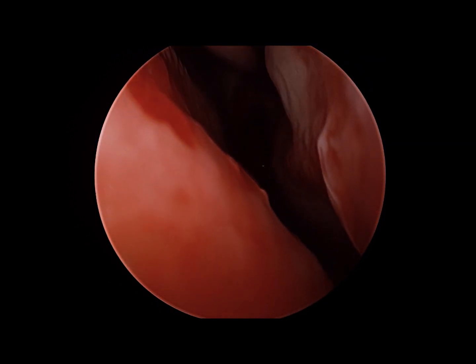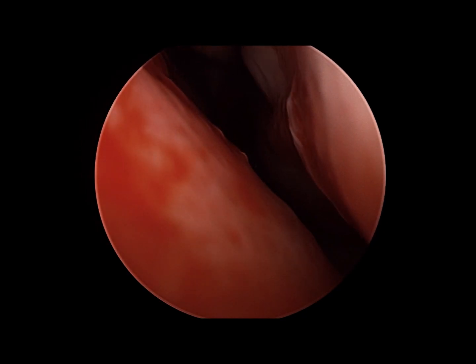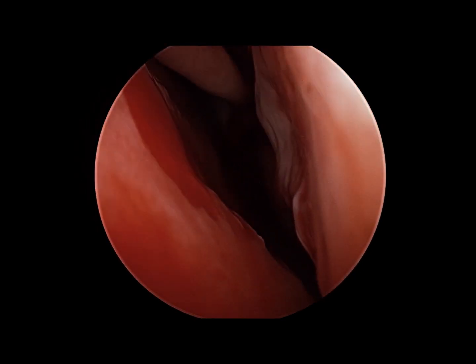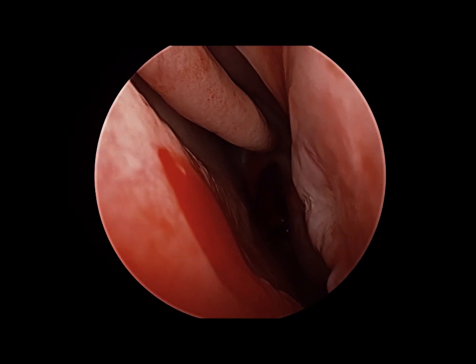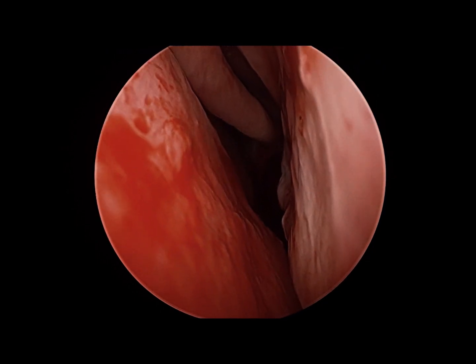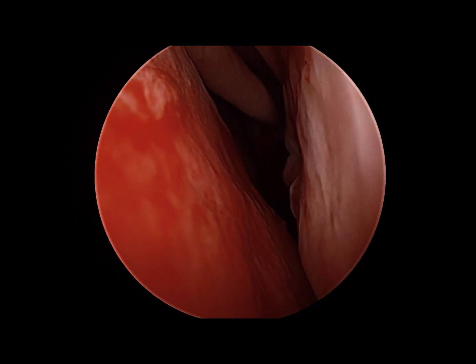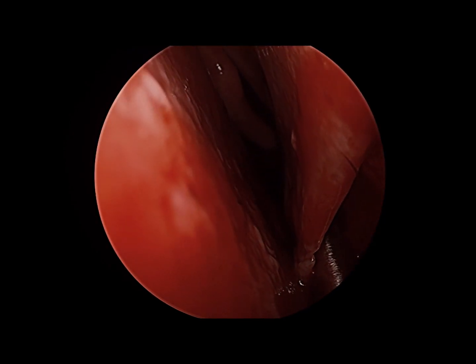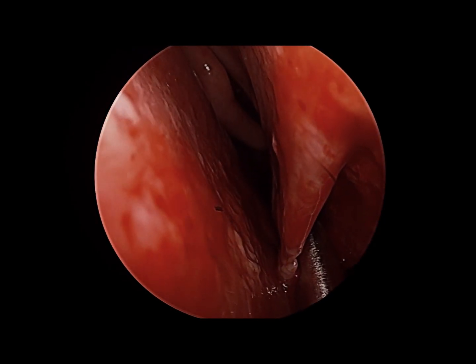Removal of inferior turbinates via scissors excision is not advised — that can potentially lead to problems such as dryness of the nose, crusting, or most significantly empty nose syndrome, which is an issue of paradoxical obstruction as well as dryness and the sensation of suffocation in these patients. We wish to avoid that.